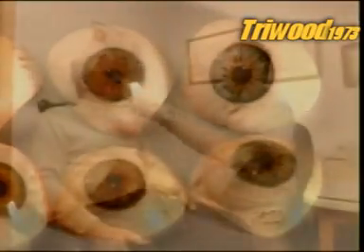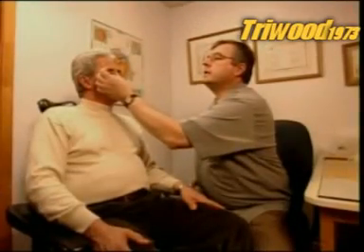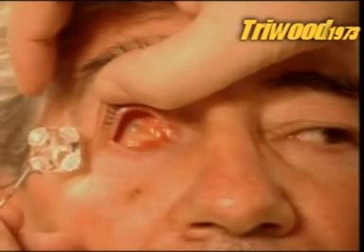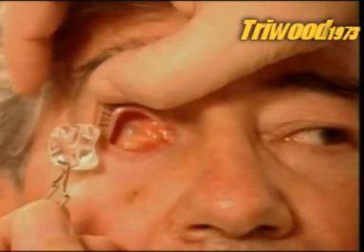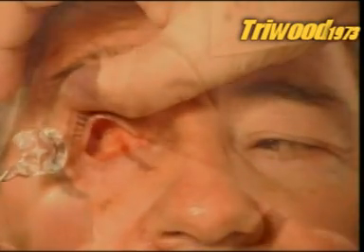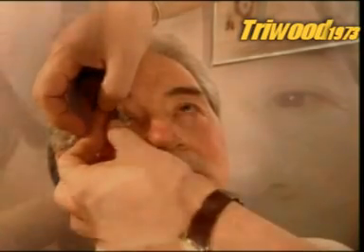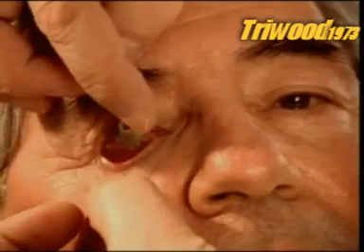If you've lost an eye in an accident or to a disease, a specialist known as an ocularist can fit you with an artificial eye. You can get a ready-made model, or a custom-made prosthesis like this one, for which this patient's being fitted. No two people's eye sockets are the same, so the first step is to take an impression.